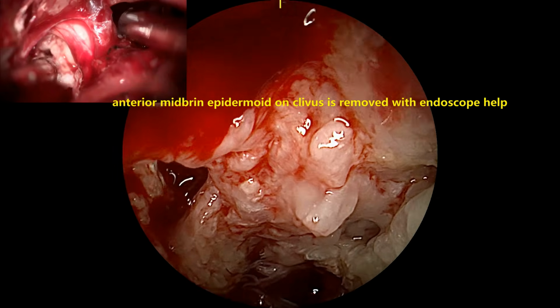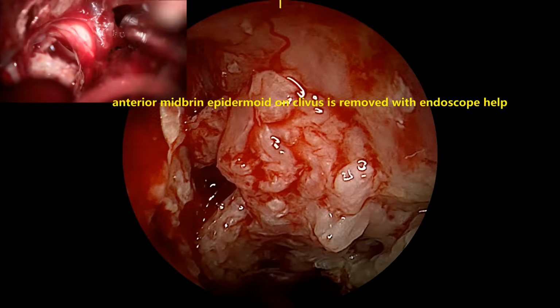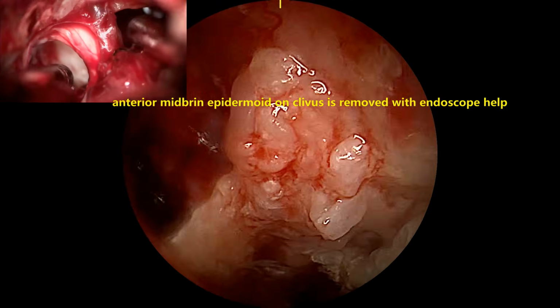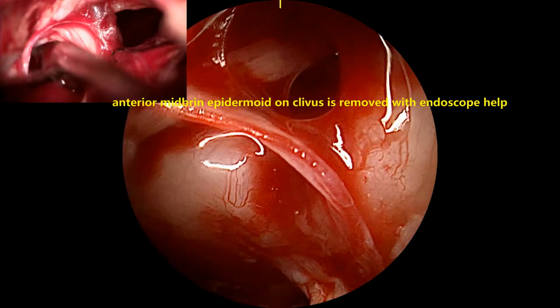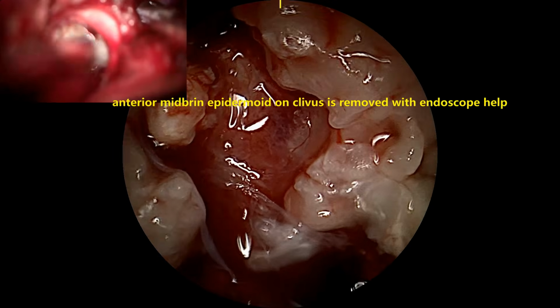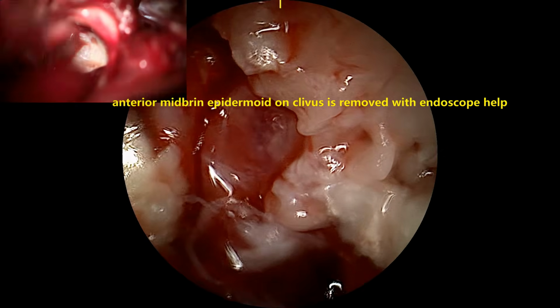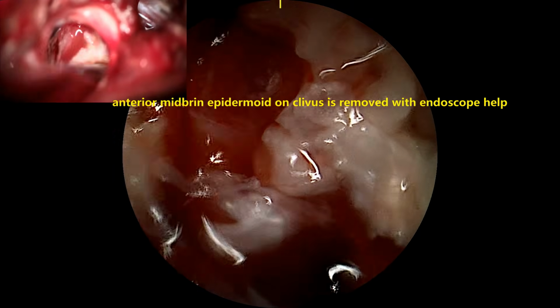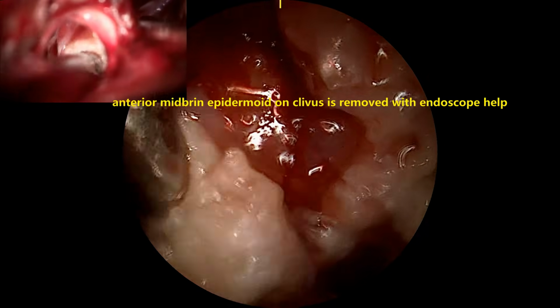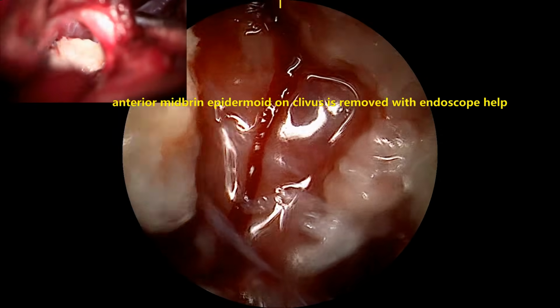Still there is a tumor anterior to the midbrain at the level of the clivus or posterior clinoids, which is adherent to the bone, that needs to be taken out. Now with the endoscope help, that is dissected and gently separated. The movements here need to be very, very slow and gentle, because if we damage any vein or artery during the dissection, there may be bleeding beyond your vision and that may create a problem.